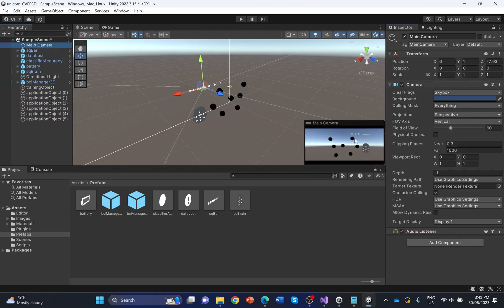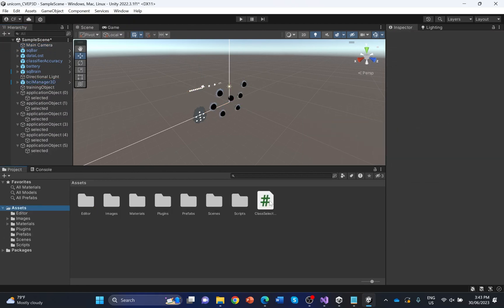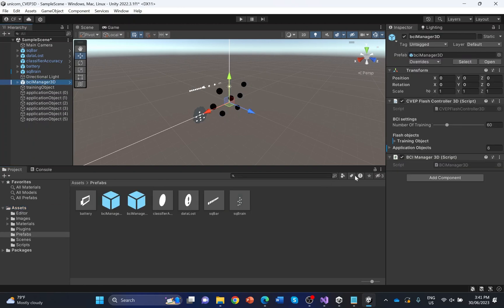The BCI is configured properly now. Training and application objects have been connected with the controller. As a final step, you have to decide what to do when you select some items with the BCI. You will find a script called ClassSelectionAvailable.cs in your assets folder. This is an example script listening to the classification results from the BCI. There are six classes in the BCI manager, therefore you will get a number between 1 and 6 whenever you focus on the corresponding application object. If 0 is returned, the BCI was not able to clearly identify an object — this should mainly be the case if you are not watching the screen or not focusing. Add the ClassSelectionAvailable.cs to the BCI Manager 3D.